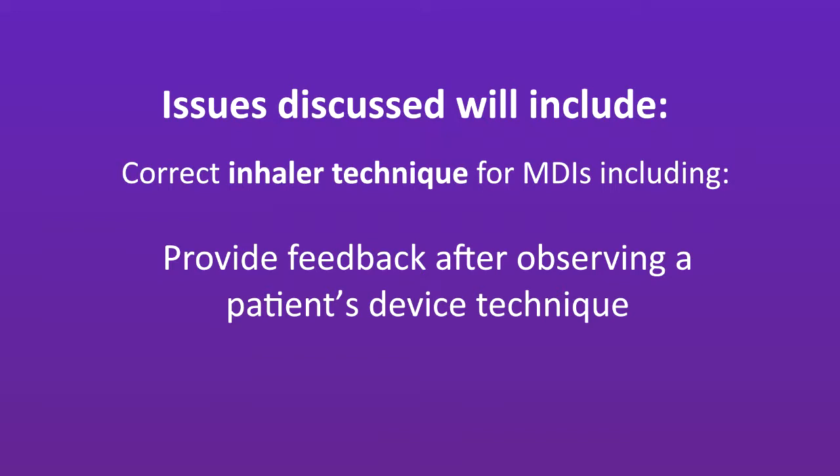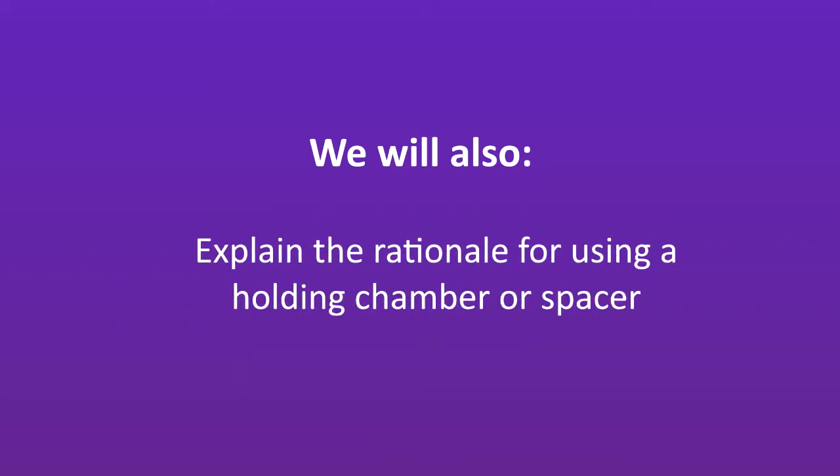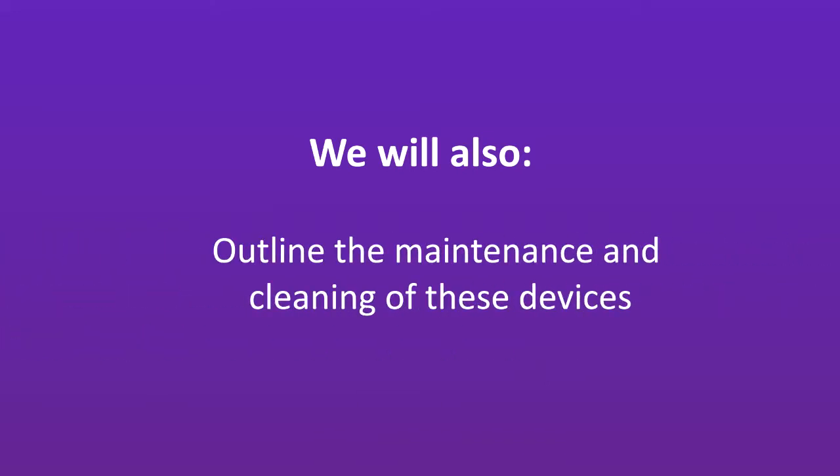Provide feedback after observing a patient's device technique. We will also review MDI issues that affect drug delivery to the lungs, explain the rationale for using a holding chamber or spacer, identify factors to consider when selecting a holding chamber for a specific patient or device to include on your formulary, and outline the maintenance and cleaning of these devices.